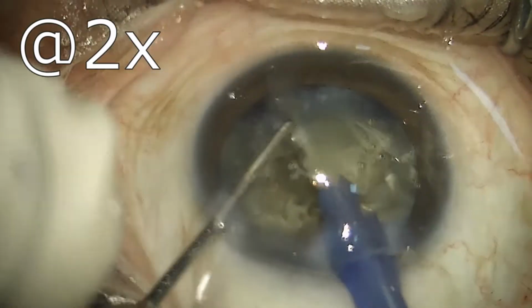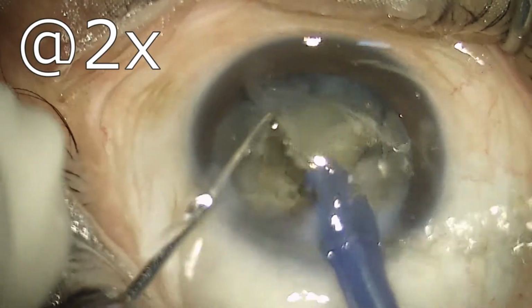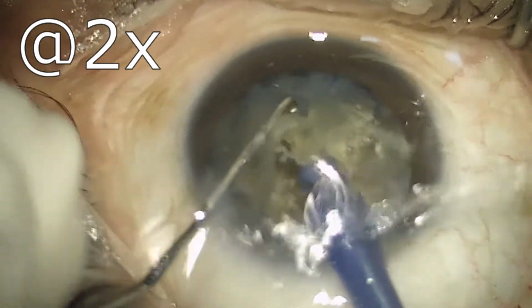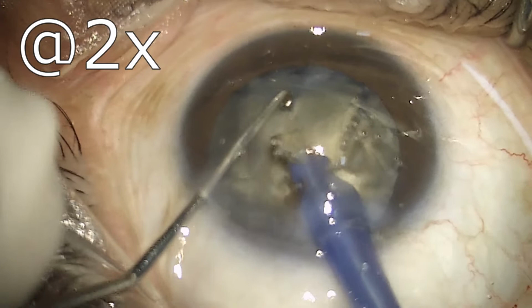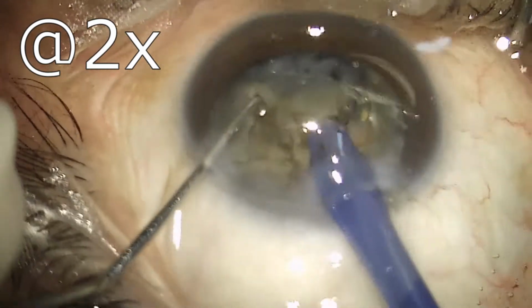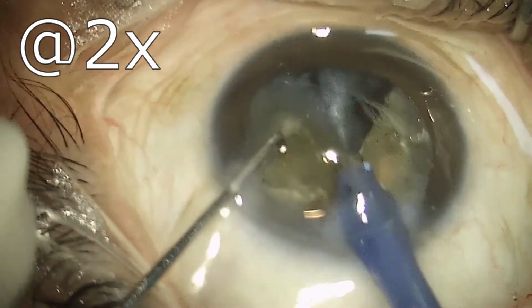Separating the posterior limit of the connected nuclear chunk. This part of the video is at twice the speed, just to make the video shorter while retaining all the key elements.